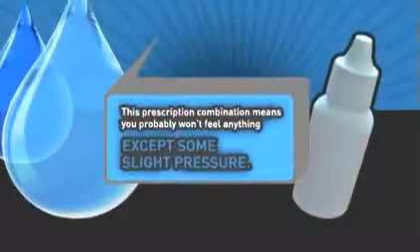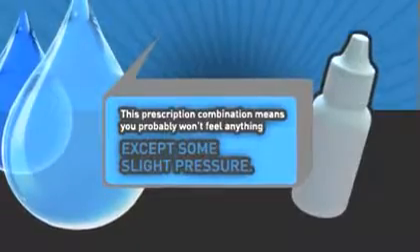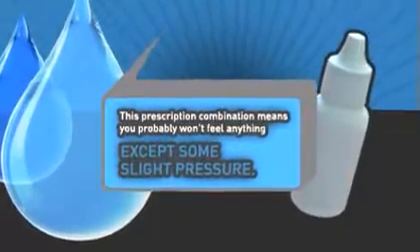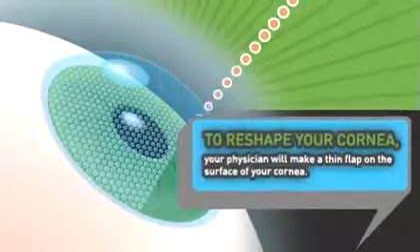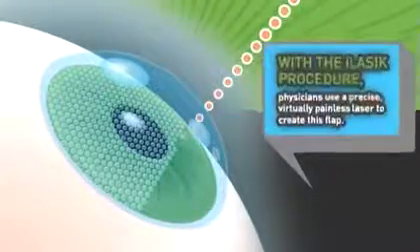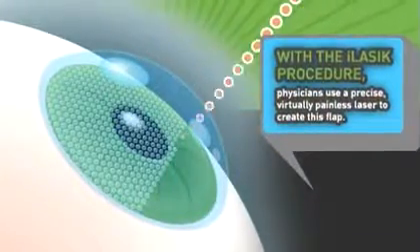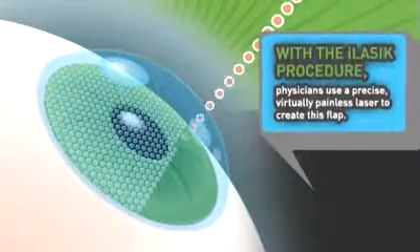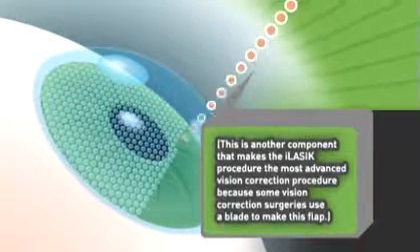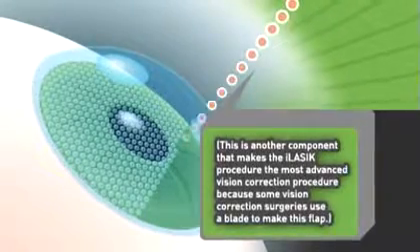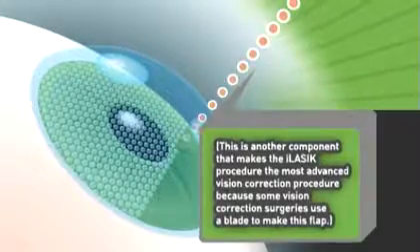This prescription combination means you probably won't feel anything except some slight pressure. To reshape your cornea, your physician will make a thin flap on the surface of your cornea. With the iLASIK procedure, physicians use a precise and virtually painless laser to create this flap. This is another component that makes the iLASIK procedure the most advanced vision correction because some vision correction procedures use a blade to make this flap.